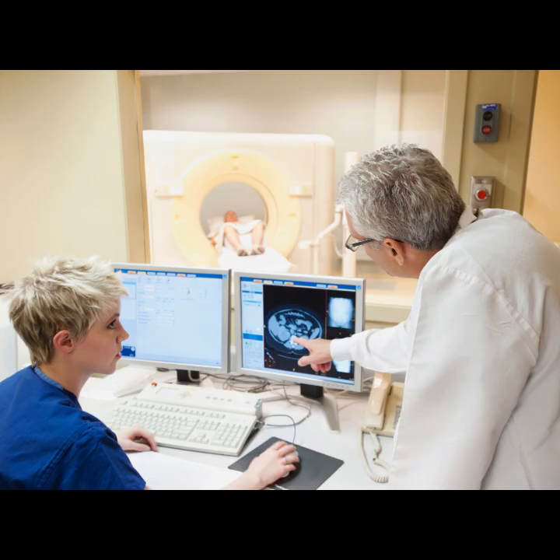The resulting paths achieve a fundamentally more balanced and uniform sampling density distribution across the whole of K-space. And what that means is the resulting point spread function, the PSF, has significantly reduced side lobes. So we're solving the artifact problem more in the acquisition domain, not just pushing it down the line to reconstruction.